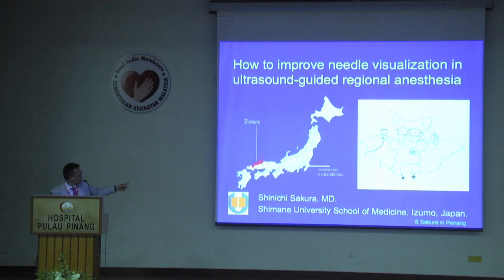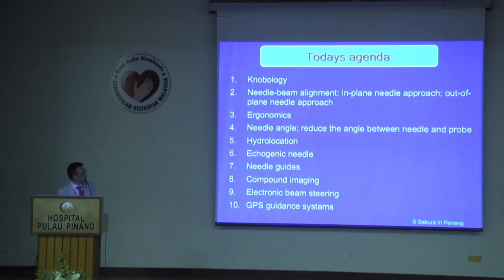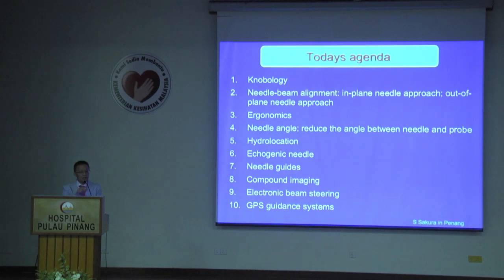Ultrasound guided regional anesthesia has become increasingly popular these days because it can improve the success rate and also decrease procedure-related complications. Since it requires real-time visual control of the needle manipulation, needle tip visibility is critical to safety and success. I'd like to share with you today information on how you could improve needle visualization in ultrasound guided regional anesthesia.